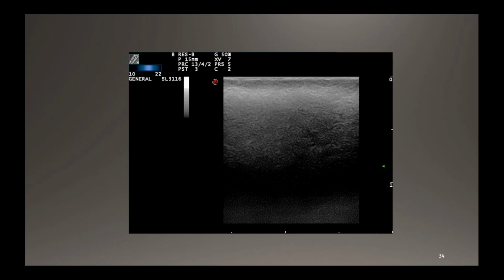Then, the thing is, the last one who touches the patient is going to assume all the consequences, good and bad, and the complications. If we had used our lasers in this patient, this filler would have been activated and inflammation for months would have started. Hopefully, we saw this implant and we refused to treat this patient, avoiding this complication with lasers.